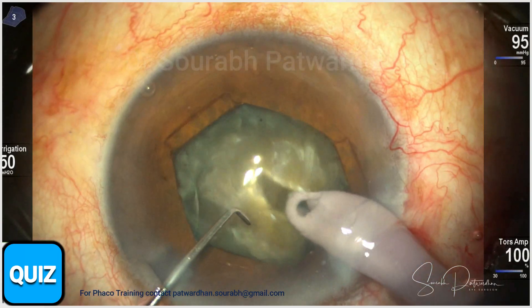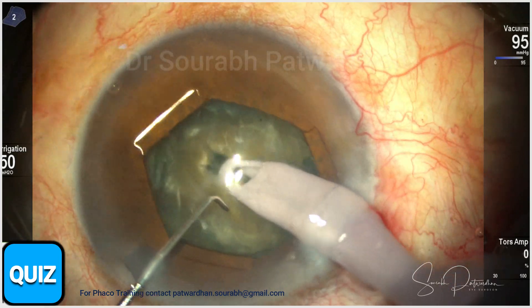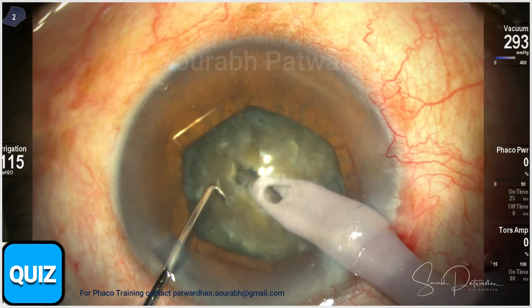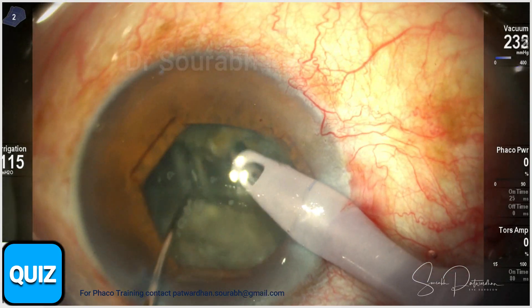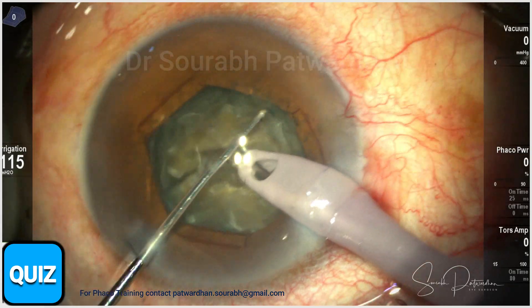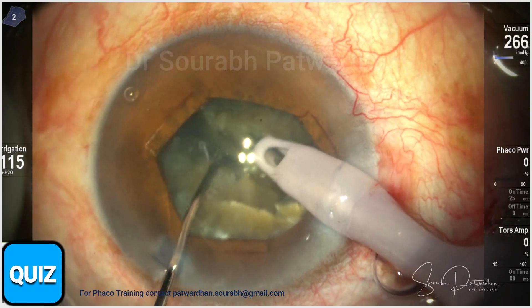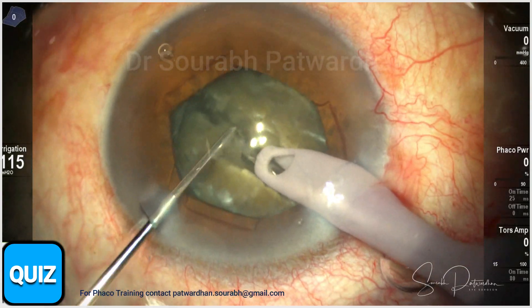This is my standard technique: half trench, then I go for the chop. You can see this is a vertical trenching technique where I don't move the phaco tip horizontally but rather give vertical trenches. Then for the first chop, I patiently wait for the nucleus to crack as far as possible using the multi-level chopping technique. This is a hard, leathery cataract.